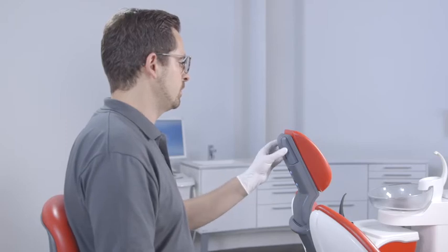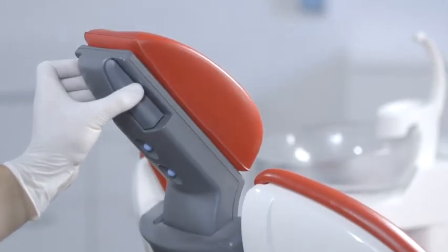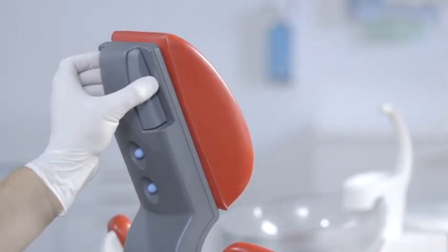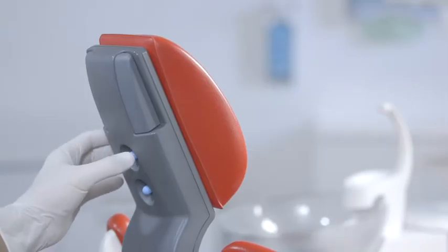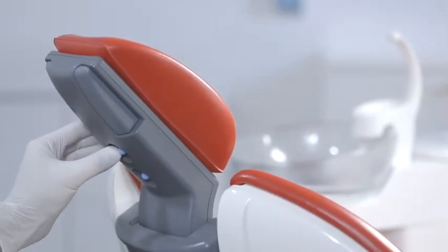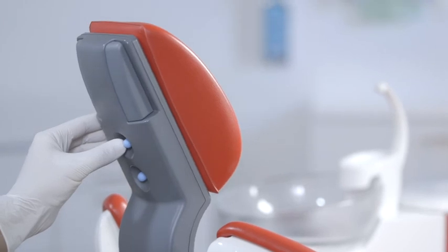The headrest can also be operated by hand, mechanically or electrically. Press the quick unlocking mechanism at the side together to move the headrest to the correct position. For electrical operation of the headrest, use the upper four-way foot control.